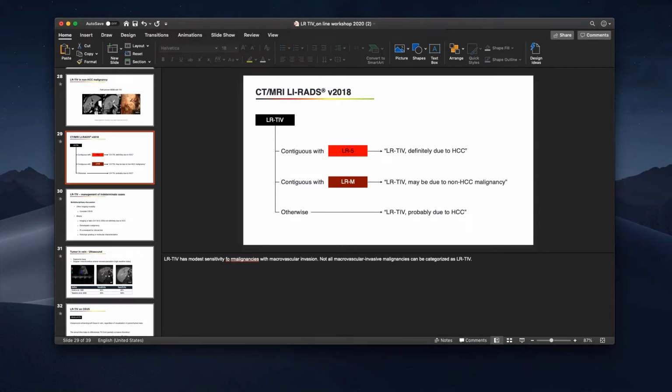So we have another question, and it's from my shy friend from Alexandria, Egypt. His name is Muhammad Eid. I purposely mentioned his name because he's shy. So he's asking, what's the Hounsfield threshold that qualifies as unequivocal enhancement? Is it 15 Hounsfield units, 20 Hounsfield units?